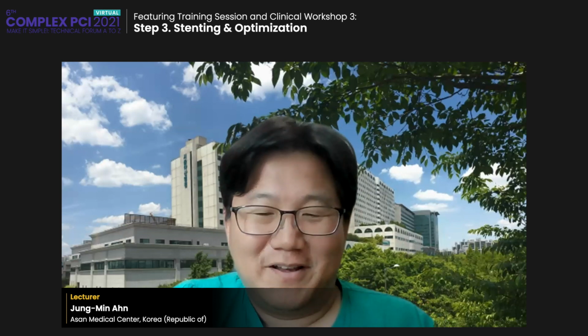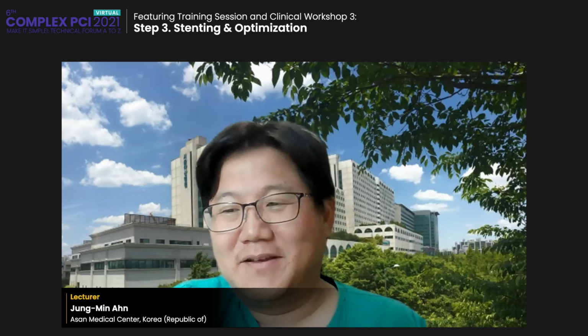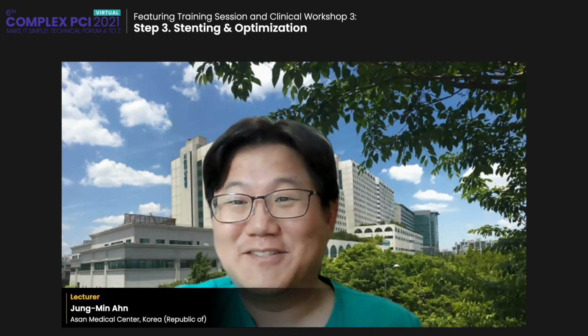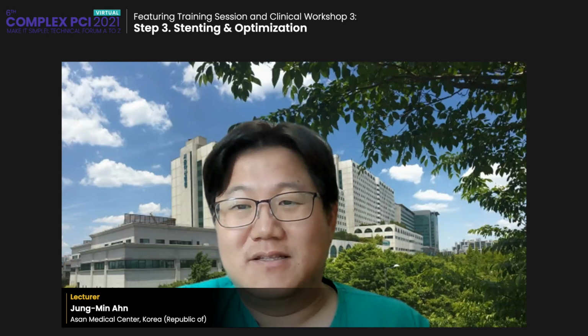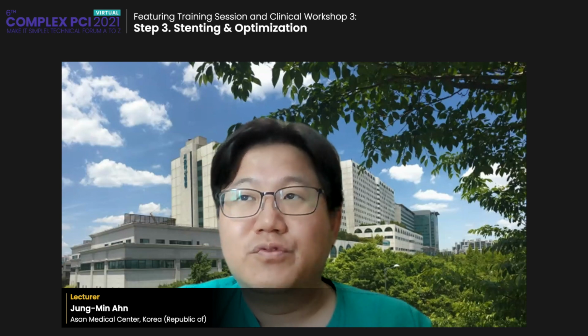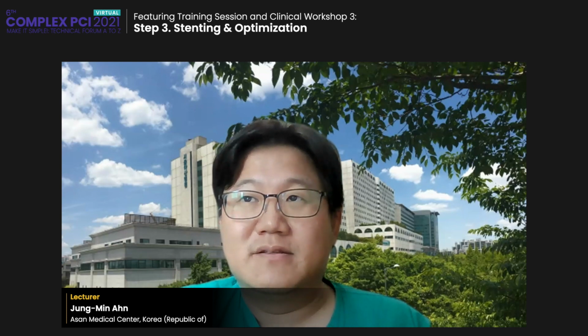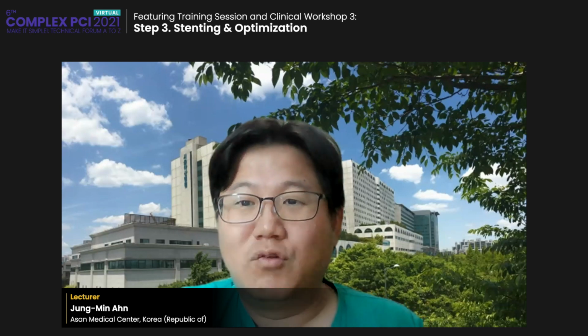Yeah, thank you for a very, very important question. Actually, I'm addicted to imaging-guided PCI, so I always use IVUS in any case, even in simple cases. But to prove the benefit of IVUS guidance or IVUS-guided post-dilatation strategy in simple cases is almost impossible.